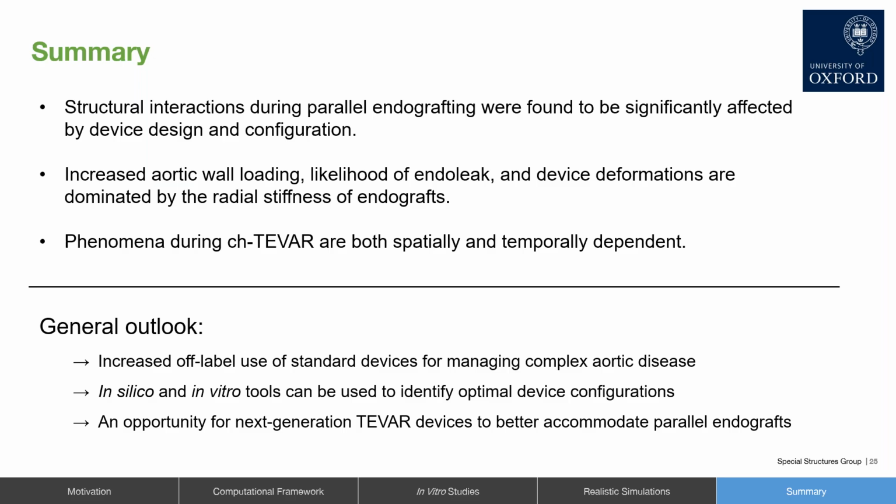Now, for the device manufacturers perhaps in the audience, what we see here is a real opportunity for next generation TEVAR devices to better accommodate parallel endografts so that surgeons have more confidence going into these procedures to minimize the risk of adverse events such as gutters and device compression.